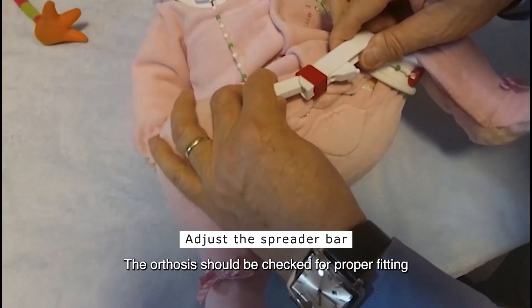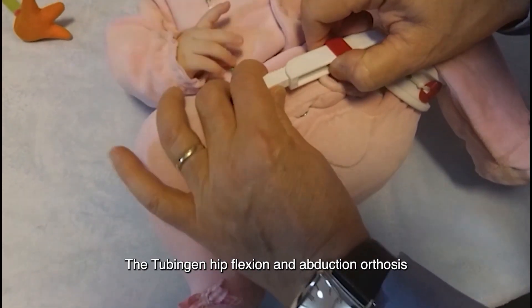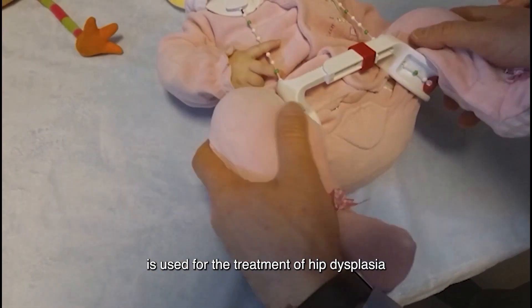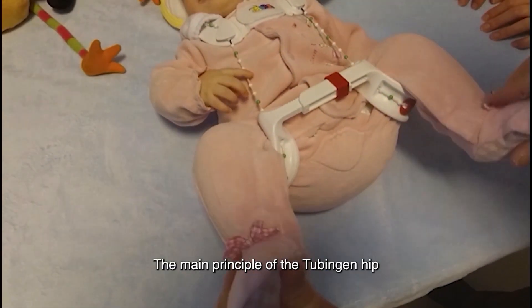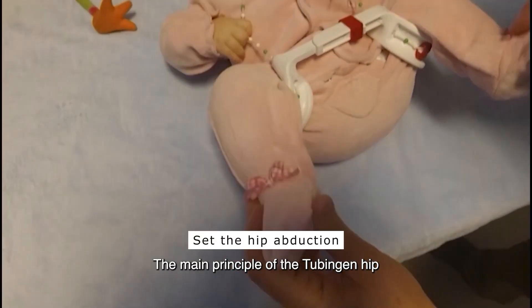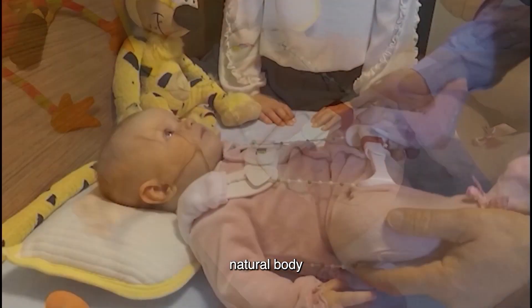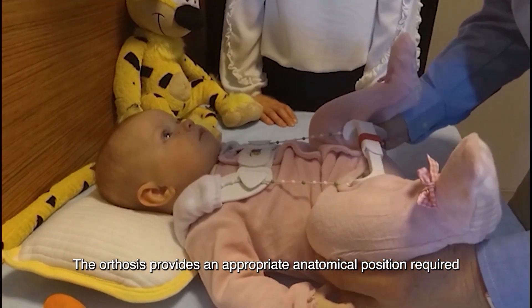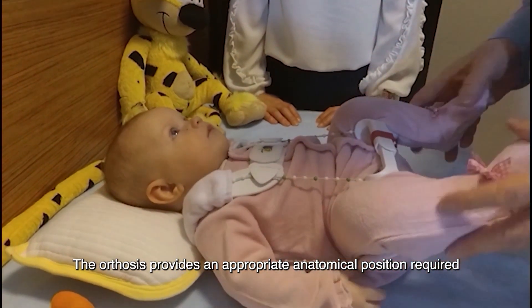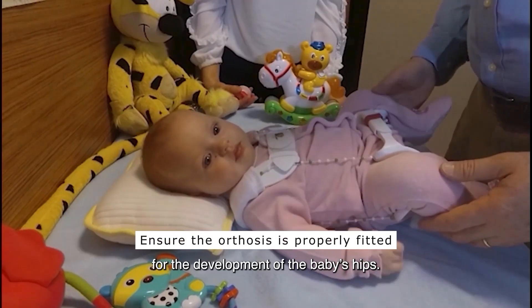The abduction of the baby's legs should be approximately as wide as the shoulders. The orthosis should be checked for proper fitting with the baby. The Tubingen hip flexion and abduction orthosis is used for the treatment of hip dysplasia in infants. The main principle of the Tubingen hip orthosis is to provide the baby with a natural body position similar to that in the womb, providing an appropriate anatomical position required for the development of the baby's hips.